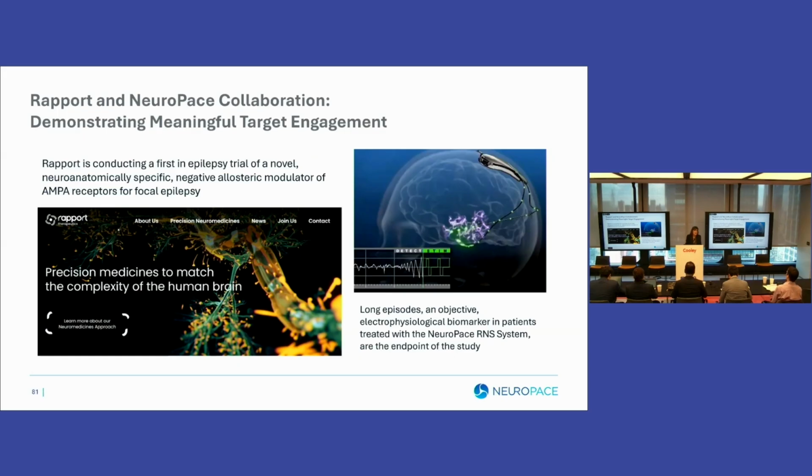Now, this company wanted to perform the very first study in people to see if there is target engagement, and based on that experience to make the decision about whether to invest in clinical development. They came to us and said, we understand from your publications that long episodes are biomarkers for patient clinical response, and we want your long episodes to be the endpoint of our study. This is a whole new paradigm in very early drug development.